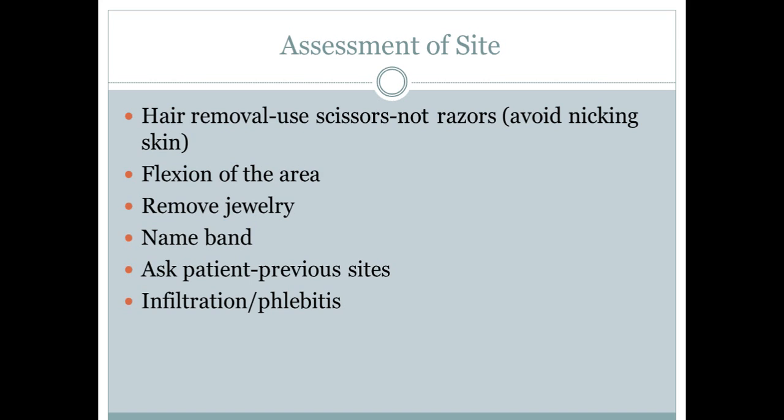I'm also going to remove any jewelry on that side. That could even be included with the patient's name band or allergy band. But so important that before we remove that band, we have another band there at the bedside ready to be replaced, especially an allergy band. I can't tell you how many times I have seen nurses cut those bands off and then completely forget about putting that band back on that patient, the allergy band and what have you. Whether she got busy with another patient, but always have an extra band, an allergy band with you in case you do need to cut that off.